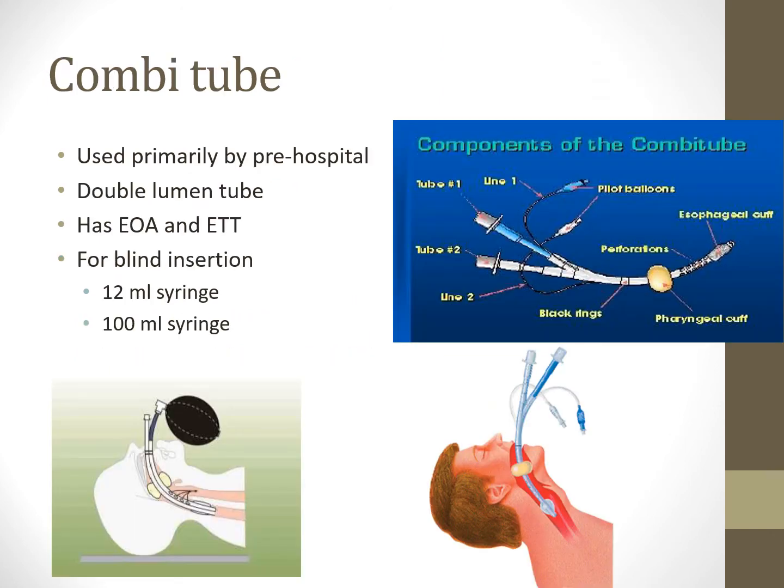All right, let's talk about different tubes. The combi tube's not used as frequently anymore, but still something that you might see somewhere in different regions of the world or in the US maybe. Primarily used by pre-hospital providers. It's meant for a blind intubation.